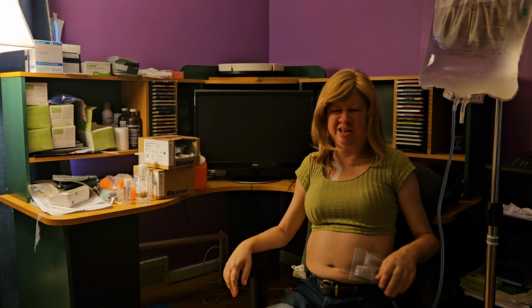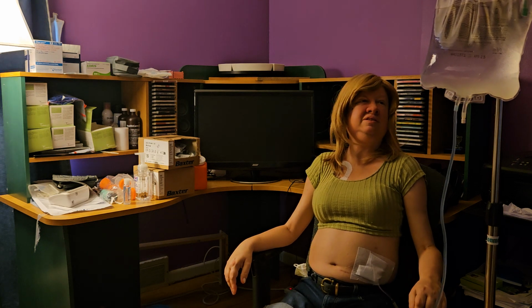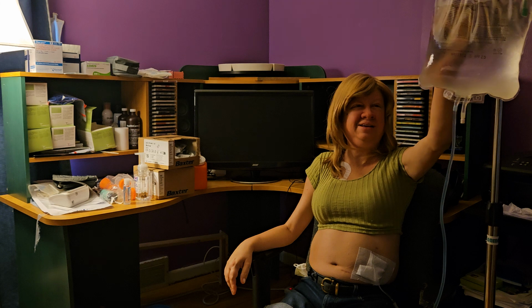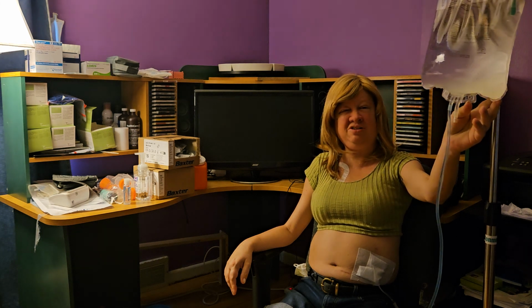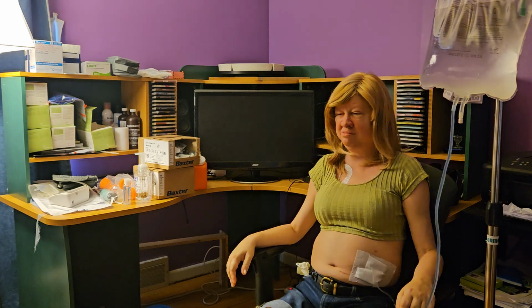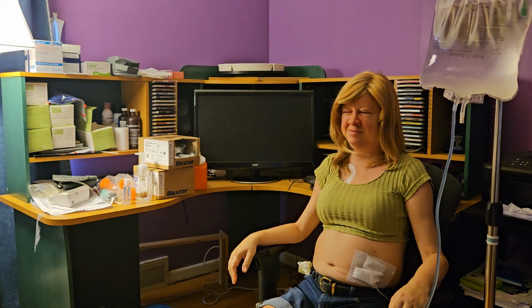Now it's going to be filling. And I don't use the whole bag because that's a 2,000 milliliter bag, and I only want to use 1,500 milliliters. So when it goes down to about here, we just stop it and throw out the waste fluid.